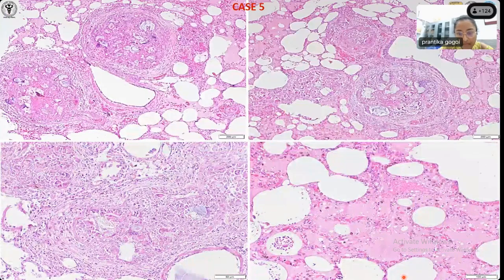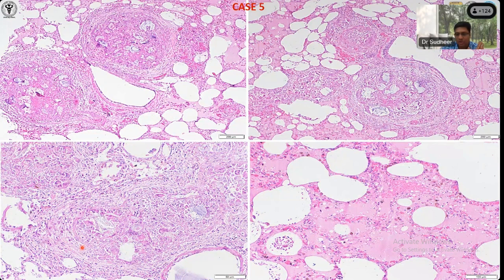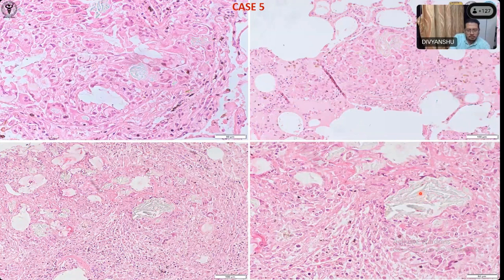Pulmonary embolism. Let's see. Again, there are many vessels that I am highlighting here. Can you see? You can make out some part of the vessel wall and adjacent lung parenchyma showing what? What is this eosinophilic material accumulated in the alveolar lumen? Pulmonary edema. Yes, pulmonary edema, associated pulmonary hemorrhage and edema. Right? And even if you see under high power, there are some polarizable crystalline-like structures. Why are they located within? IV drug abuse?